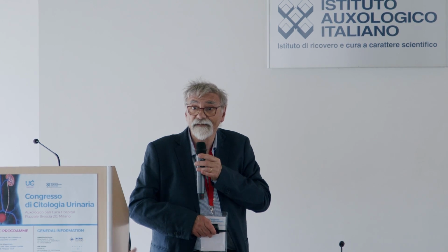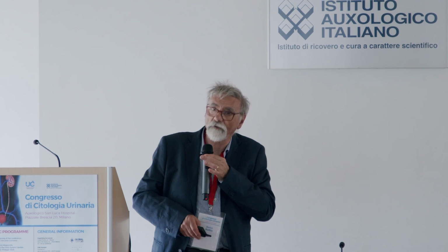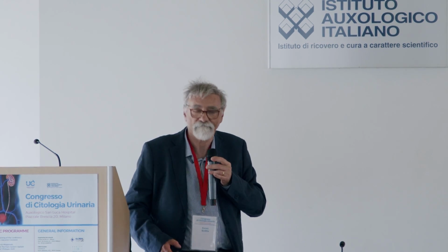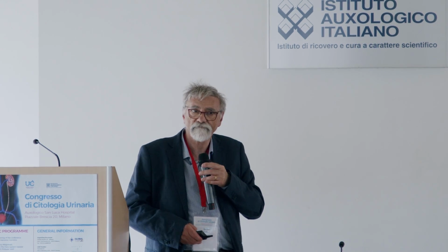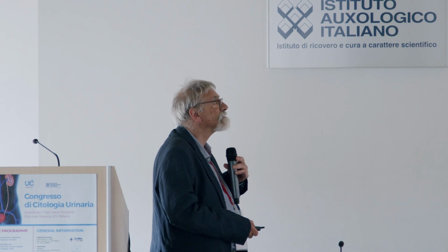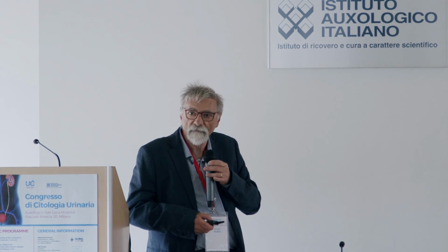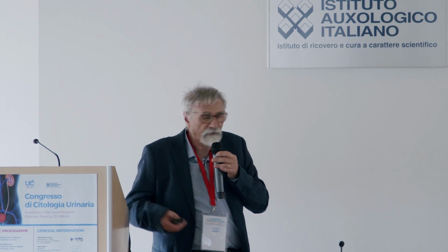In the region of the dome, yes, urachal tumor, of course. You can have a mucinous metaplasia, and this is why I think Gazzano is right, that probably the cells that you mentioned were already part of this population. But I wouldn't say that it's malignant. I would say that these are metaplastic cells. Okay, yes, this is possible.